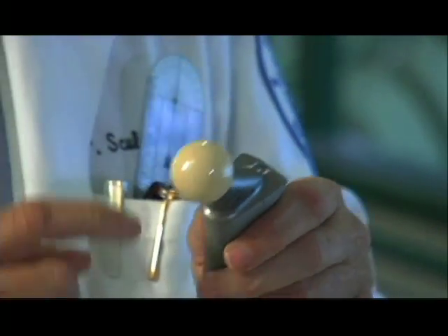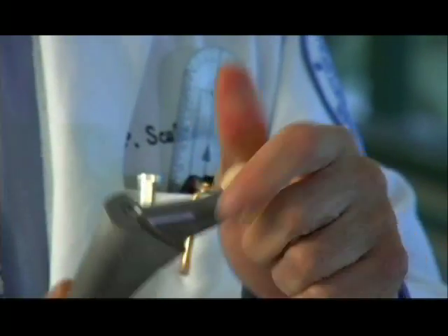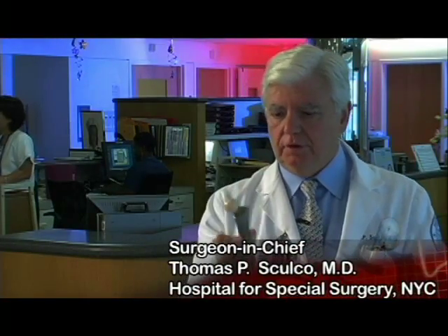The other thing you notice here is the ball, and the ball in this case is ceramic — a very, very dense ceramic. This has been in a drawer bouncing around for probably six or seven years and you can still see the surface of that ceramic is so pristine.